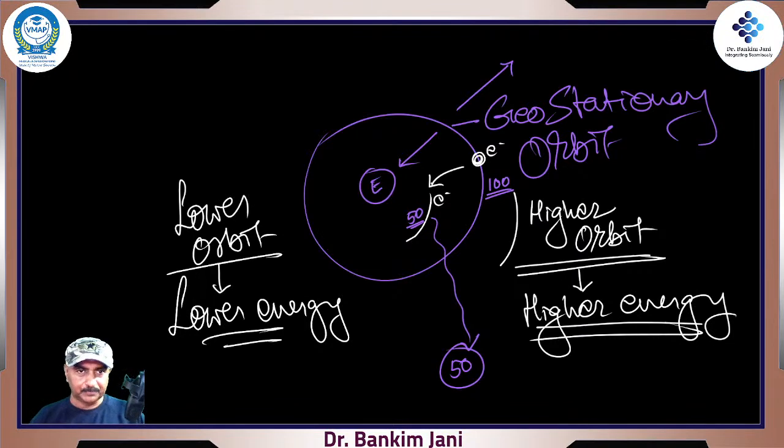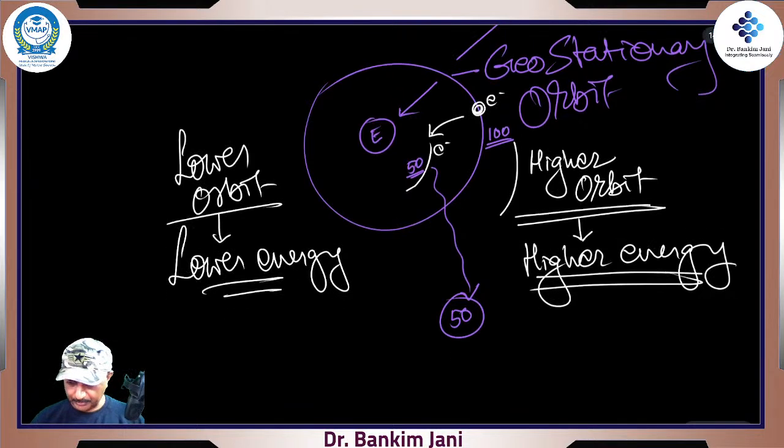What really happens is that there is a cathode and then there is an anode. From the cathode, the electrons fire and hit the anode plate, which is like a target, a tungsten target, and it would release X-rays. I'll draw it for you.